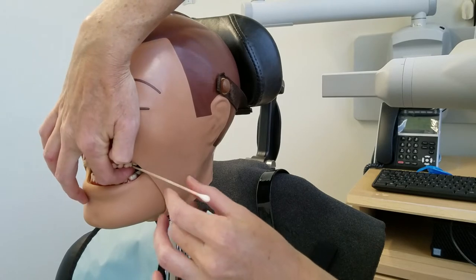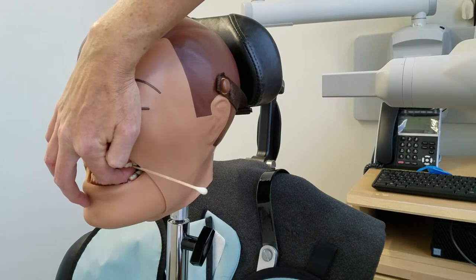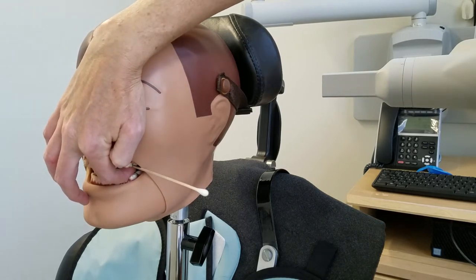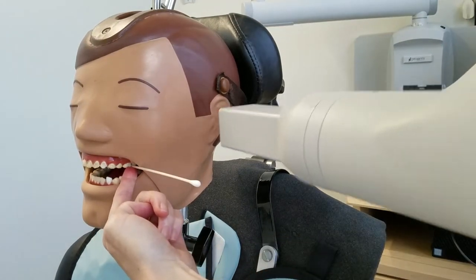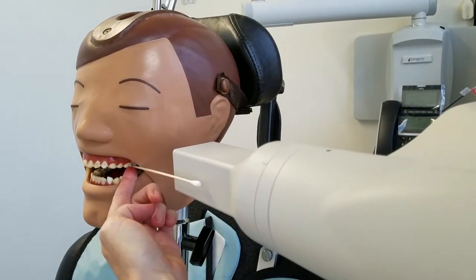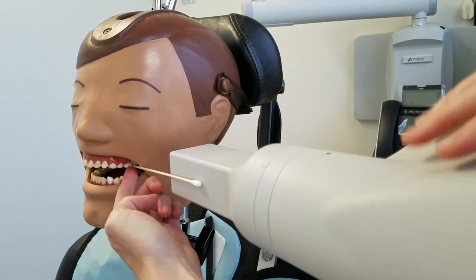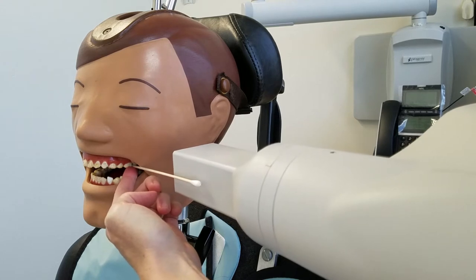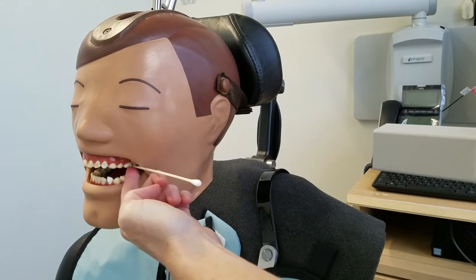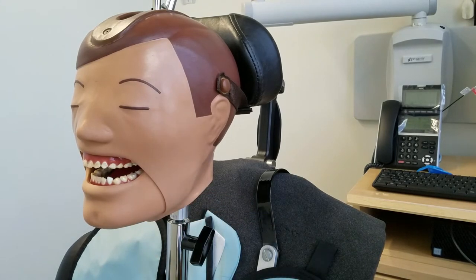We're going to get our angle by putting the cotton swab in between the first and second maxillary molar. Then we bring the BID over and match up that angle so it's perfectly parallel. Then I'm going to swing the arm — not moving the tube head — to move the BID back without changing the angle, so I won't touch that lower part. Then I take away the Q-tip.